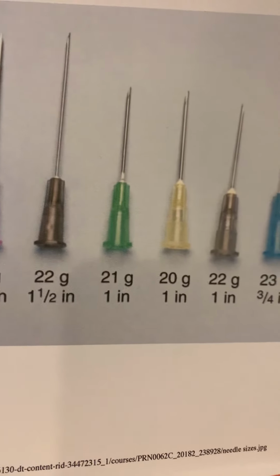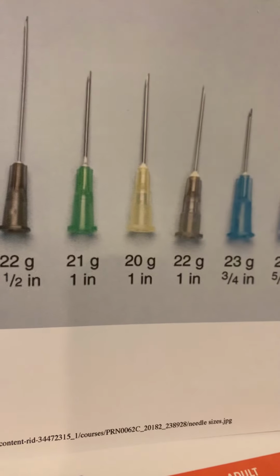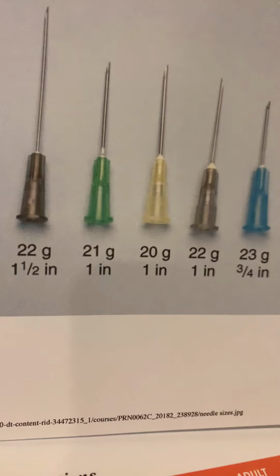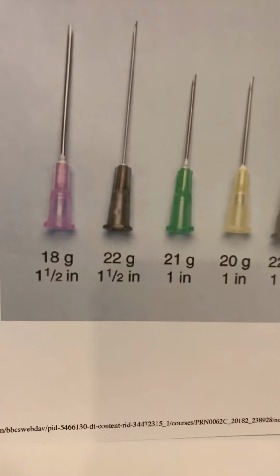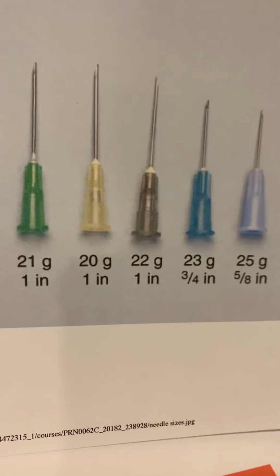So 22, 23 is probably about appropriate for that. 21, 20s, they're a little bit too wide. So be a nice nurse. I would say 22, 23 would be appropriate.